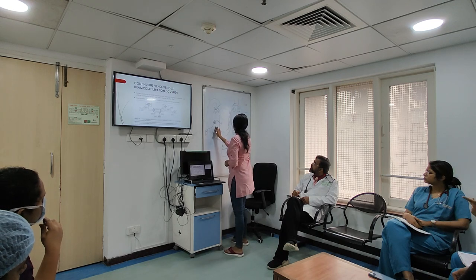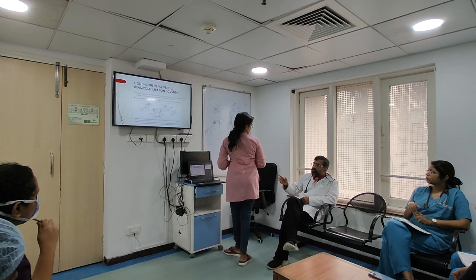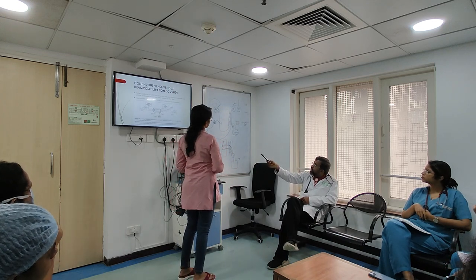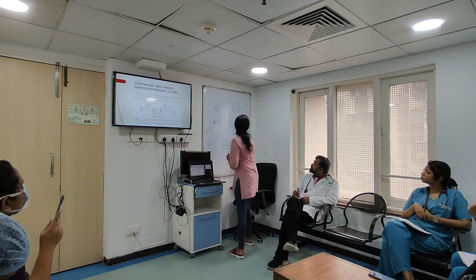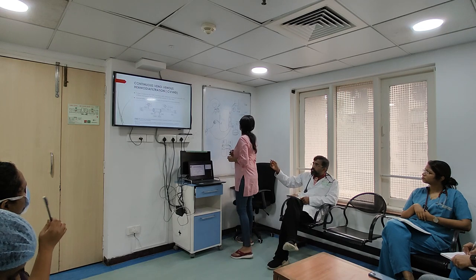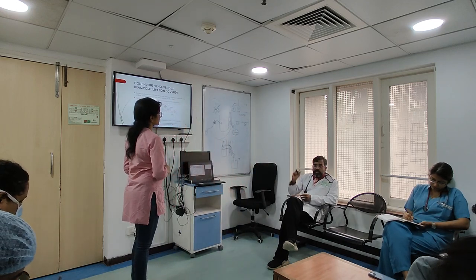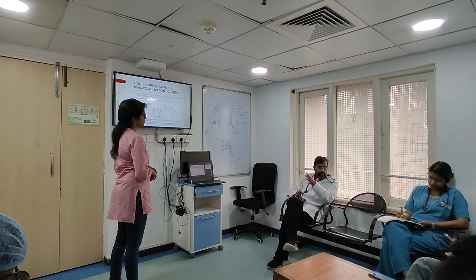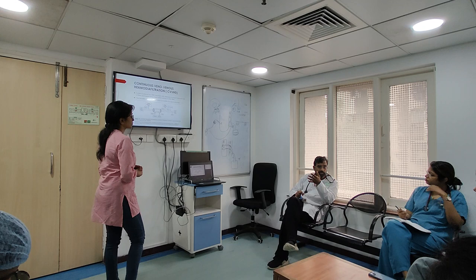One dialysate pump, replacement fluid pump, then one effluent pump, and a blood pump. So you understood now? Now where will hemofiltration, hemodialysis come? Center. So let it go across. So now you understand all those four pumps that are there outside of that machine, which actually help to conduct hemofiltration, hemodialysis, or hemodiafiltration.